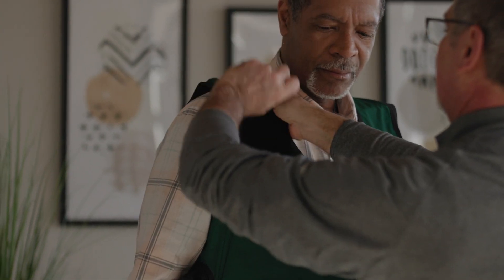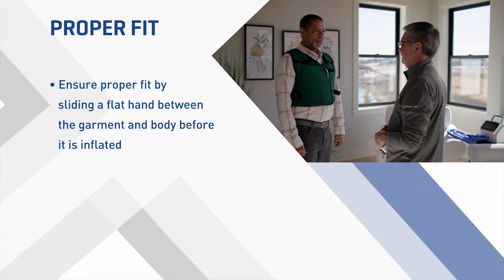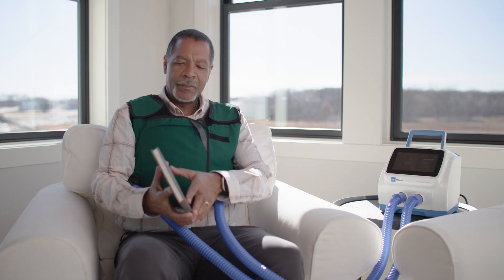Adjust the shoulder straps so that the arm holes fit snugly. Ensure proper fit by sliding a flat hand between the garment and body before it is inflated. No more than a fist width should be able to fit, as too loose of a fit can lead to ineffective therapy. Once the fit is good, start the device to evaluate the fit during therapy.